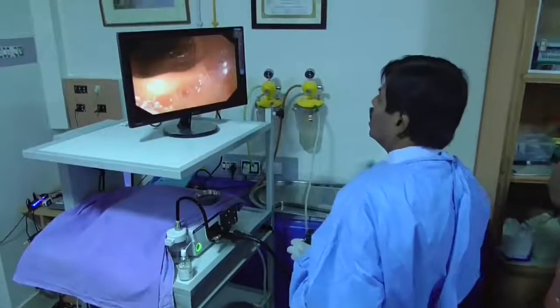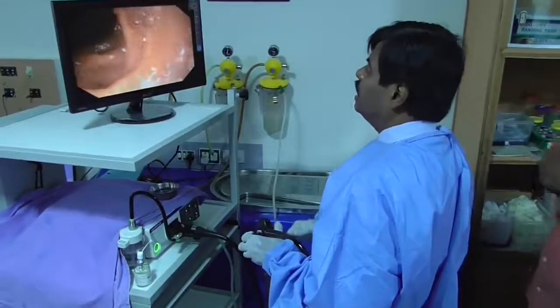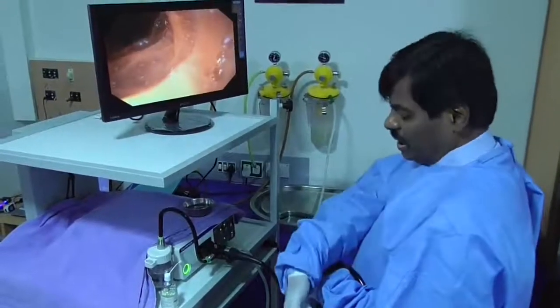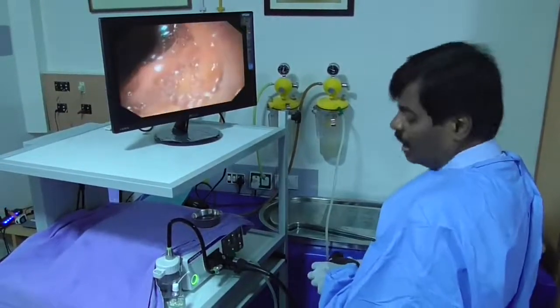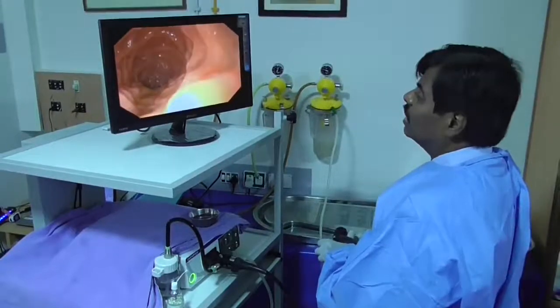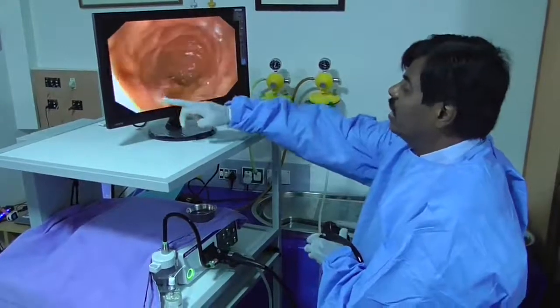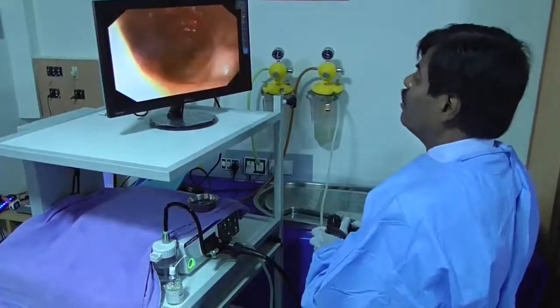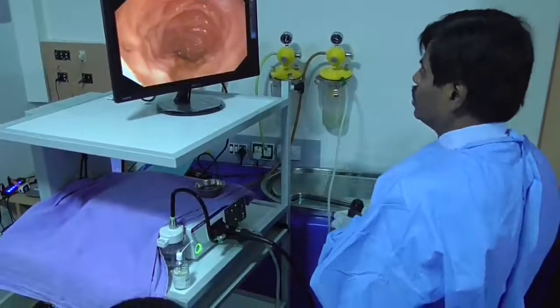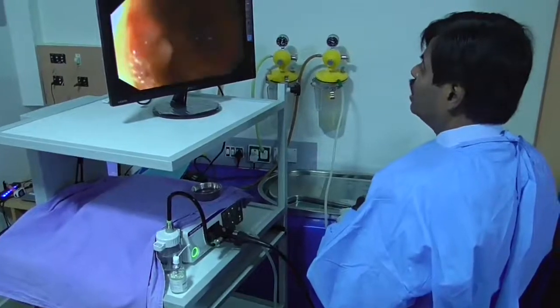Look at the monitor to keep the scope inside D2. The big wheel is completely flexed towards me and the small wheel is away from me. Now I stop advancing and begin pulling the scope — watch the number carefully: 80, then slowly 70, then 60. You will start seeing circular valvulae-like folds and one longitudinal fold. Usually at the 9 o'clock position you may see the ampulla of Vater — with a forward-viewing scope it is not always appreciated, but if visible it is usually at 9 o'clock.